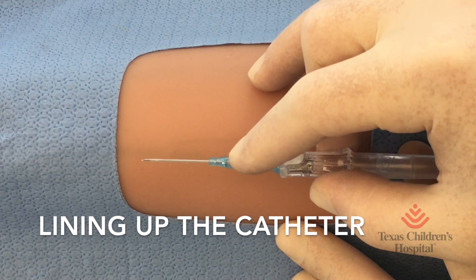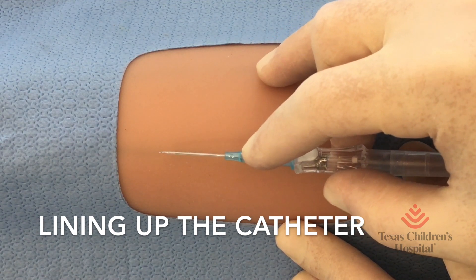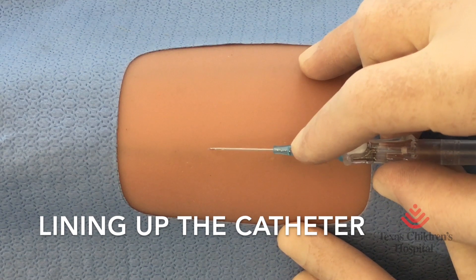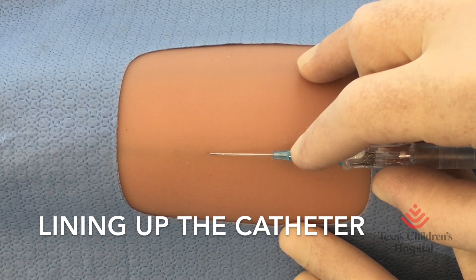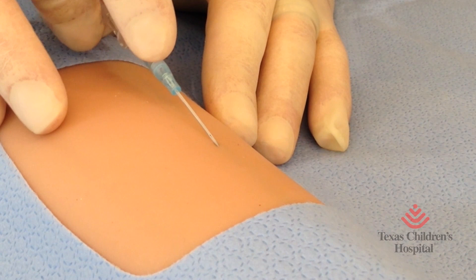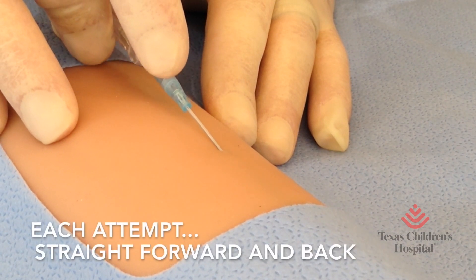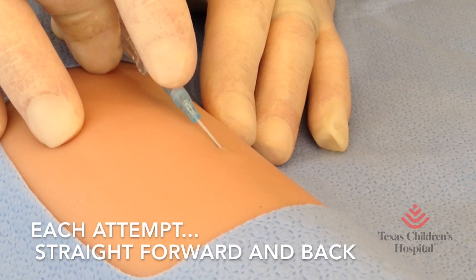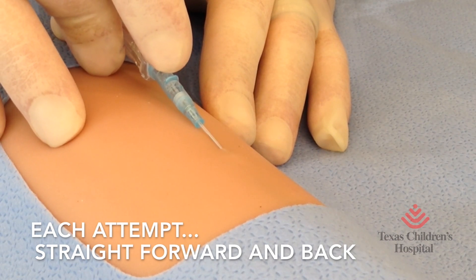Trace the vein backwards with the tip of the needle to help direct your catheter along the vein. Make a quick entry through the epidermis using a fluid, confident motion. If you miss the first time, draw straight back and try again.